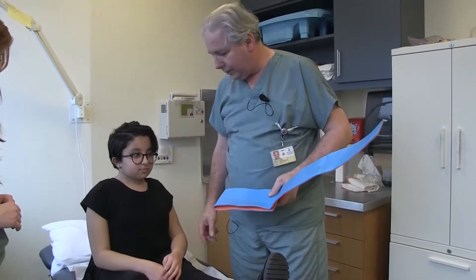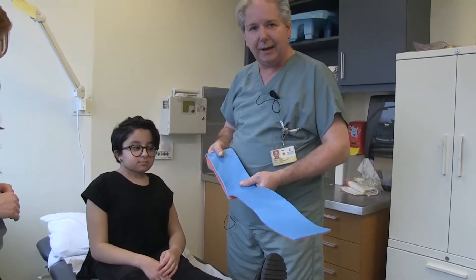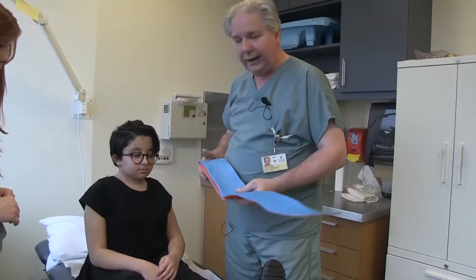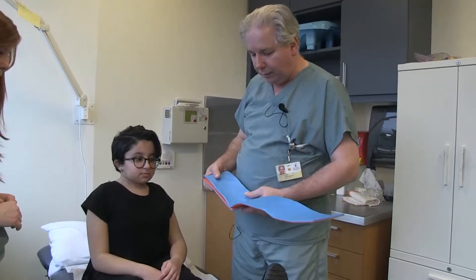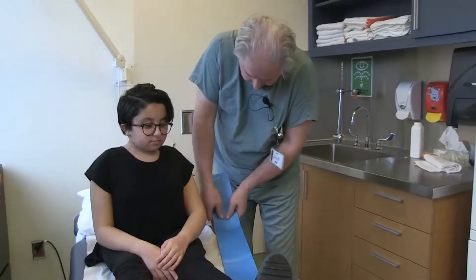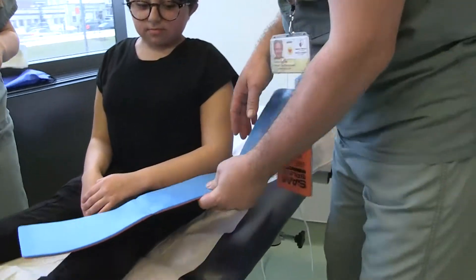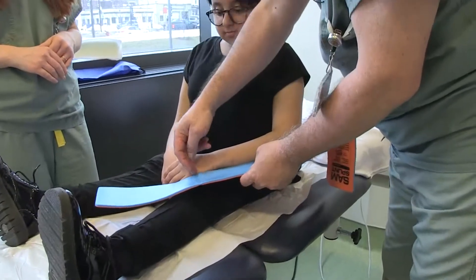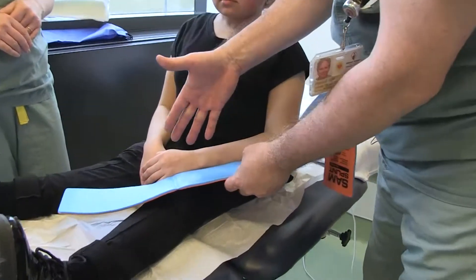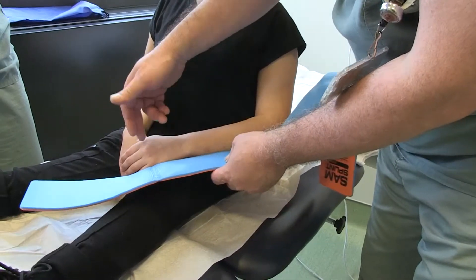We will imagine that Kenza has a fractured arm here. We will reuse our SAM splint to demonstrate its use. Here towards the back we will fold and round the brace so it forms an arm-like shape. Same thing towards the forearm. We must not try to have the exact same shape like we would with a fiberglass brace.